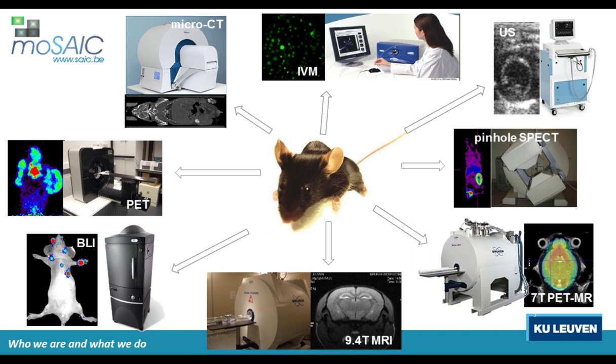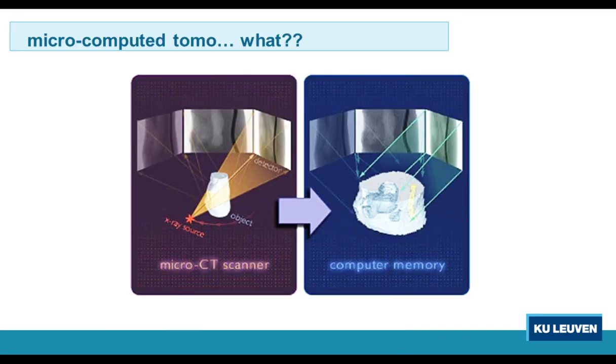And the topic of this webinar really revolves a bit around microCT, and to be honest, it's one of my favorite modalities because it's just so versatile. So I'm very eager to tell you a little bit more about our experience with that modality in this webinar. So to give a little bit of background, microCT stands for microcomputed tomography. For the ones less familiar with it, just a small introduction.